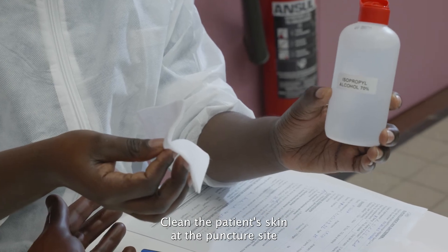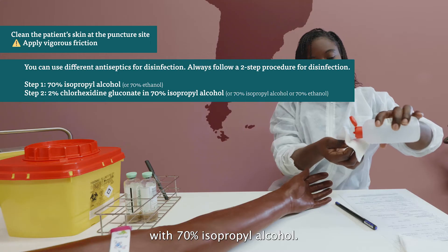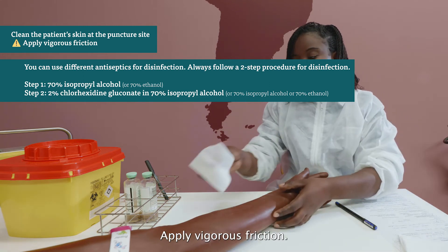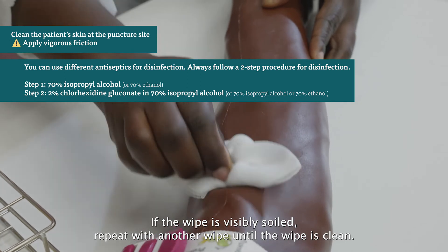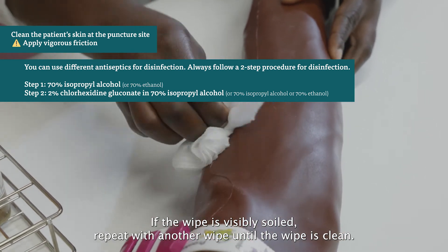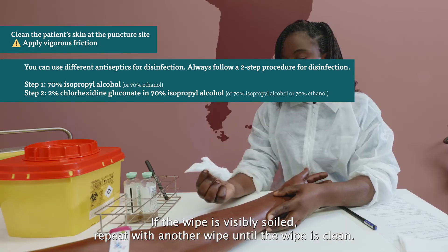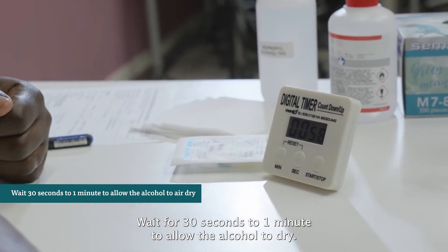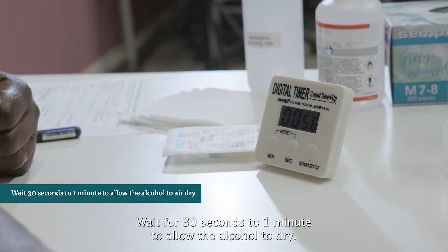Clean the patient's skin at the puncture site with 70% isopropyl alcohol, applying vigorous friction. If the wipe is visibly soiled, repeat with another wipe until the wipe is clean. Wait 30 seconds to 1 minute to allow the alcohol to dry.